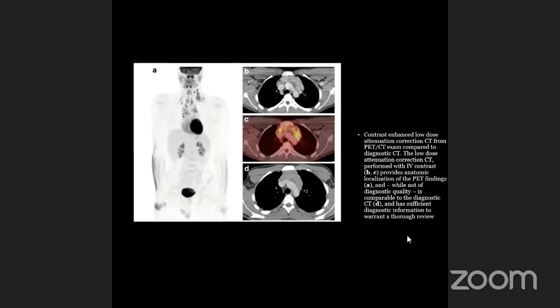Any suggestion? No. Brown fat usually in this side will show you brown fat. But what do you think about here? This is in the muscle. Do you agree that could be muscle activity? Soft tissue activity, muscle?